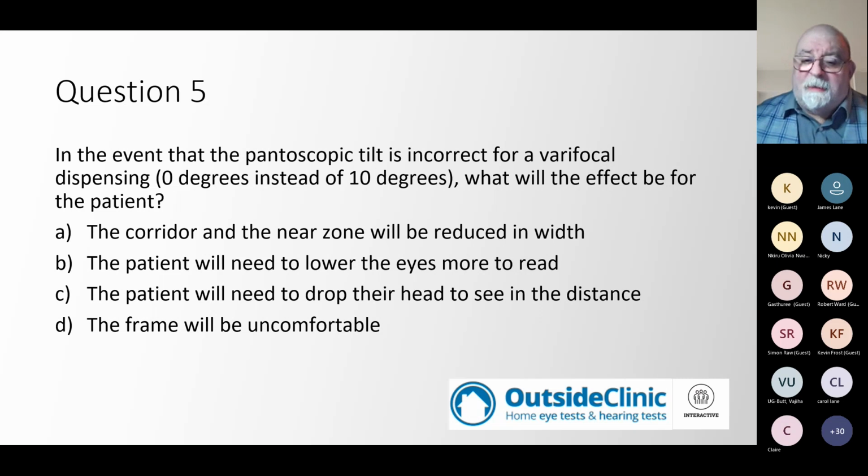Irrespective of whether you're dispensing in practice or dispensing in a patient's home, we need to make sure we're doing this one particularly for varifocal dispensings.